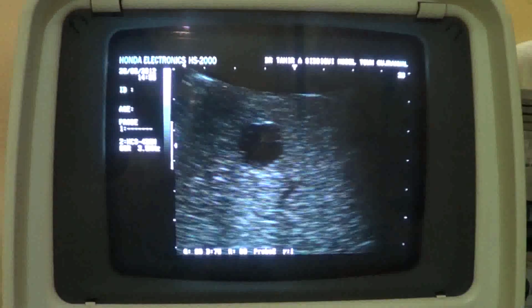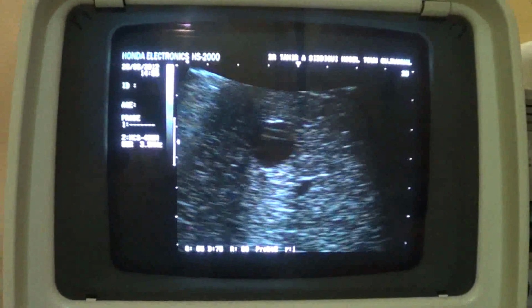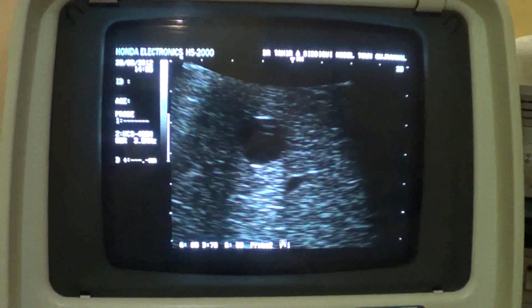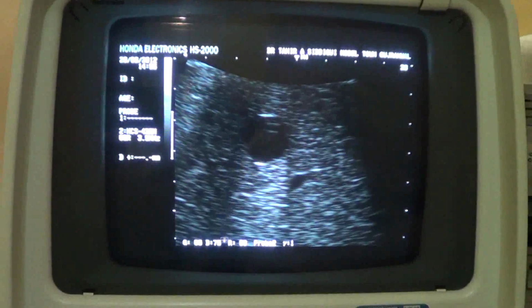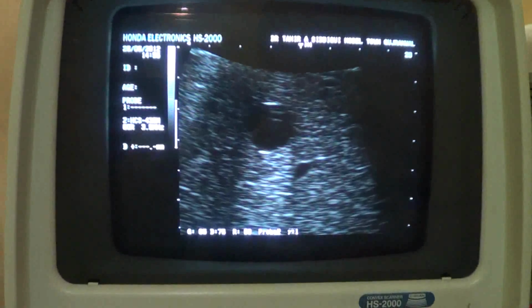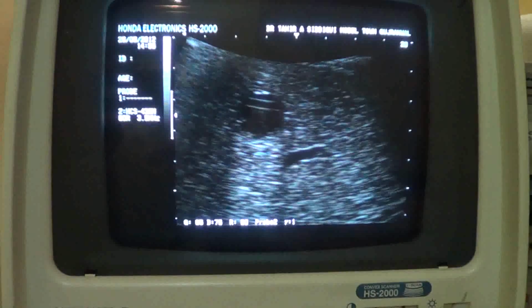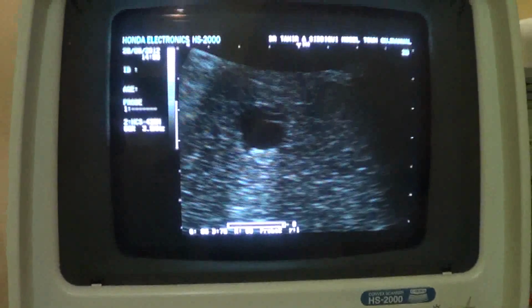in a cirrhotic liver. Now you are seeing a shadow from the margin of the cyst. This shadow is called the critical angle shadow. This black line is the critical angle shadow, and between these two lines the bright area is the acoustic enhancement from the liver cyst. This is segment 1 of this patient. Okay.